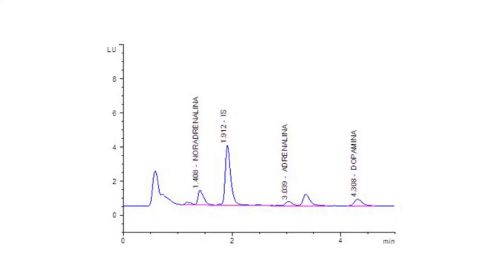This is a typical chromatogram of the plasma calibrator where the peak of noradrenaline comes out at 1.41 minutes, the internal standard at 1.91 minutes, while the peak of the adrenaline at 3.04 minutes, finally the dopamine at 4.31 minutes.